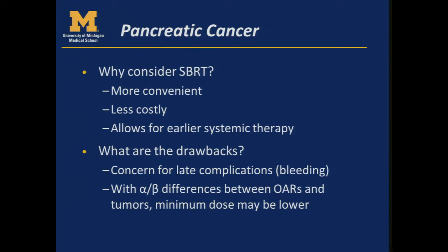So I'm going to move on to pancreatic cancer next, and then after kind of an abdomen session, I'll turn it over to Martha to talk about abdominal considerations for planning. For pancreatic cancer, why even consider SBRT? It's much less commonly used than for liver cancer, but the rationale would be that it's more convenient, it's less costly, and allows for earlier systemic therapy.